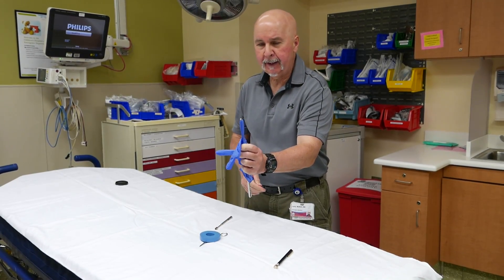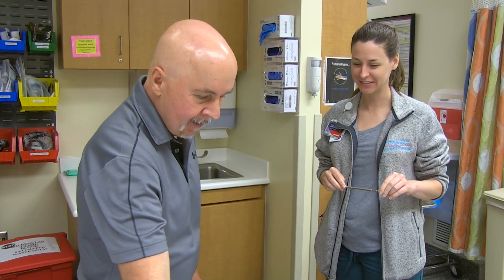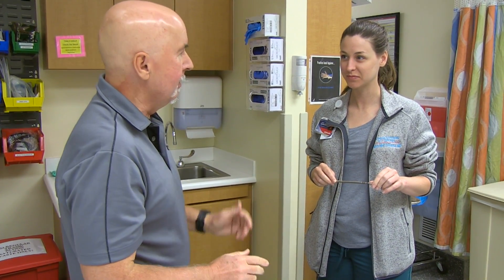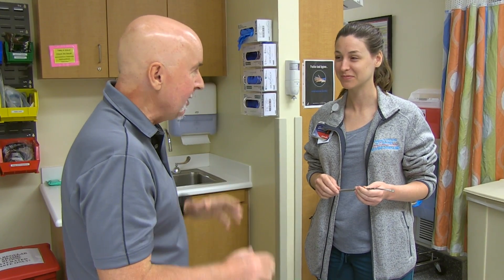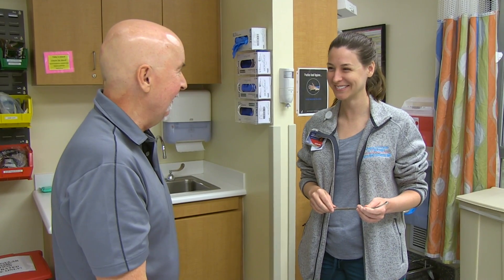And does that work? Yes, it works. So what I'm going to do is lay my head down on the gurney, and then your job will be to drop this battery in my ear, shake the helix and tragus around, make sure it's seated down there good, and then we're going to see if this will come out.